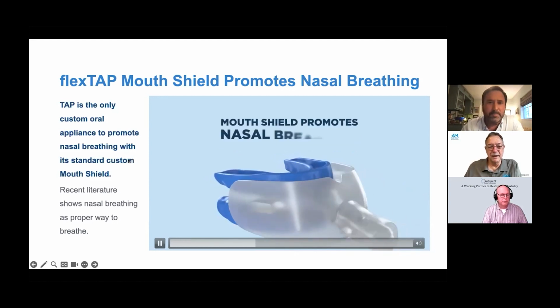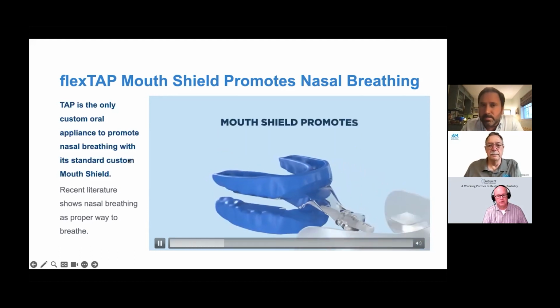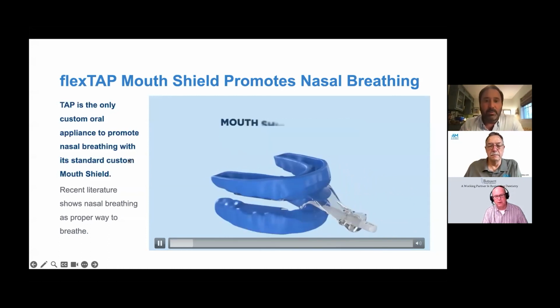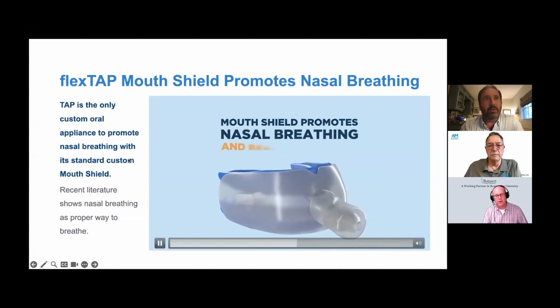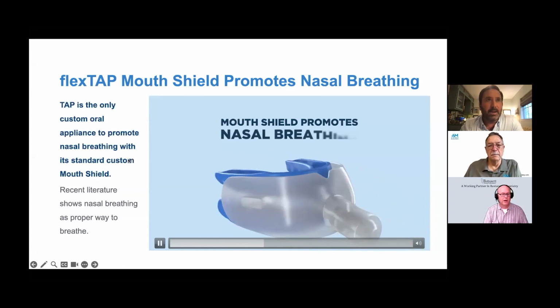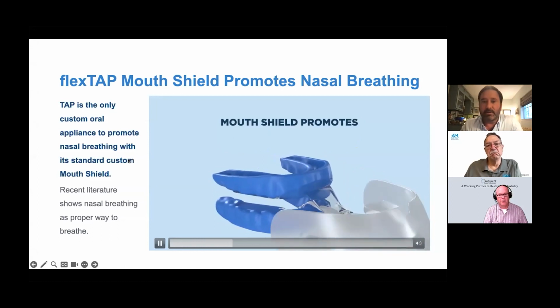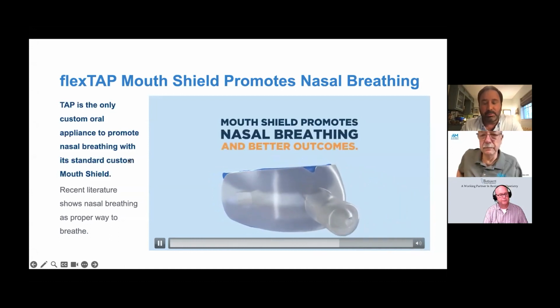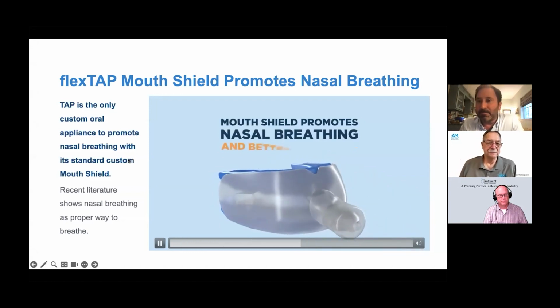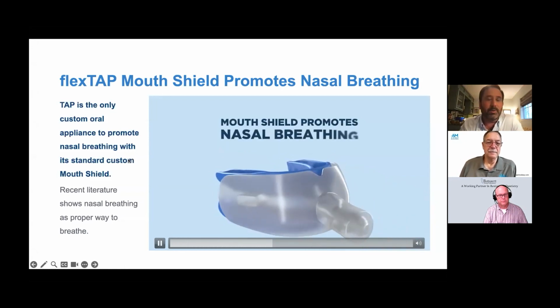So Charles, on that note, what is the patient care for these? Is it just rinsing under cool water with a toothbrush? Periodically, you can use toothpaste. We are testing right now some high acid cleaning solutions, because we have had some feedback that this blue liner, while it hides funk, can show calcium deposits. So we're looking, but that would be done probably once a month or something to that effect.